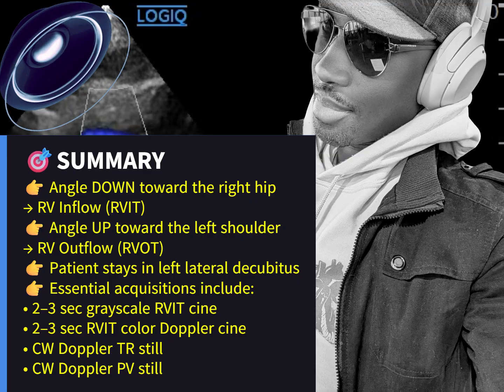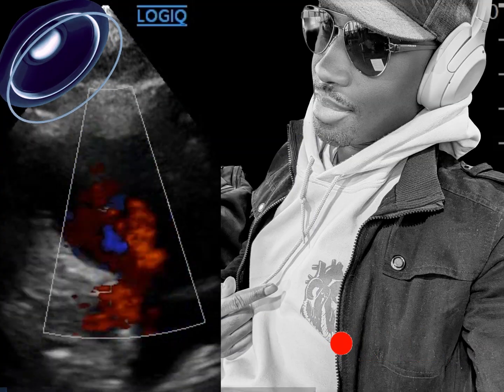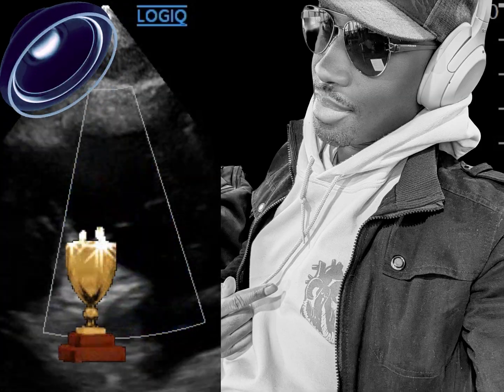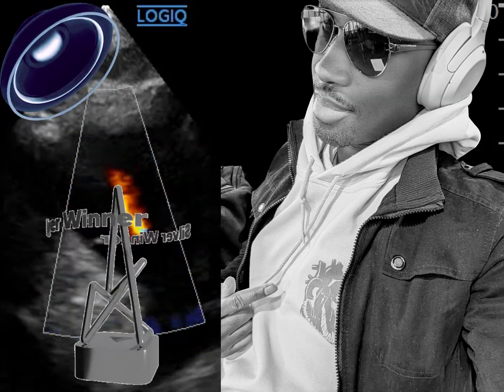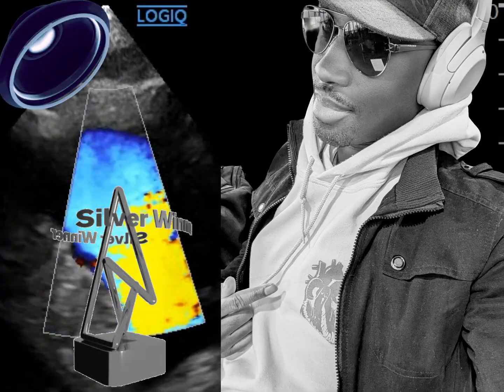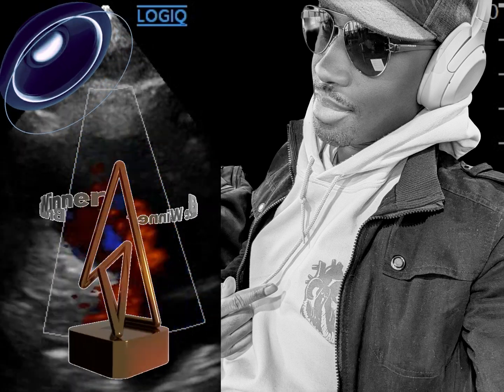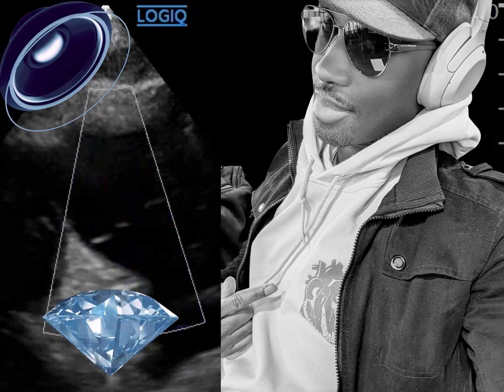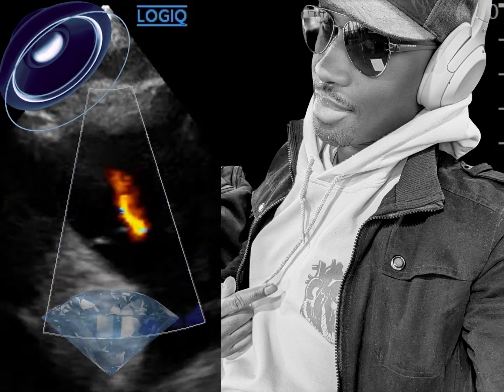Necessary acquisitions include three things for both the RVIT and the RVOT. First, capture a 2 to 3 second grayscale cine clip for both the RVIT and the RVOT. Second, capture a 2 to 3 second color Doppler cine clip for both views. Third, capture a continuous wave Doppler still image showing TR velocity. Finally, capture a continuous wave Doppler still image showing PV Vmax and insufficiency.